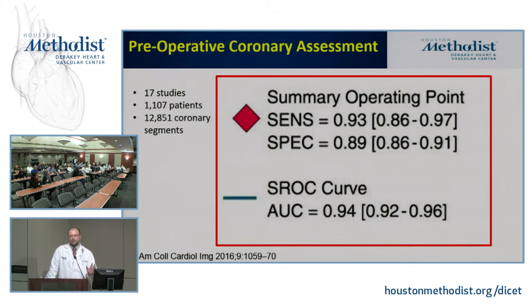So I just want to set the expectation of everybody, right, that you're going to have some patients where it may not work, but most often, at least, we are able to see the proximal segments and clarify if there is a disease that needs to be bypassed at the time of surgery. And so when push comes to shove, we try it. Again, most of the time we always try it.